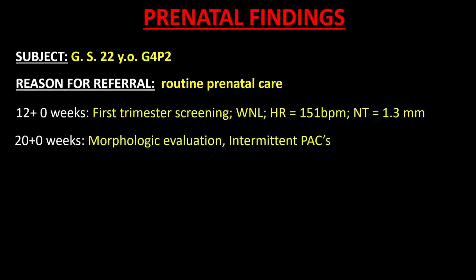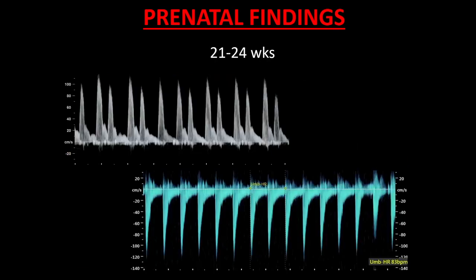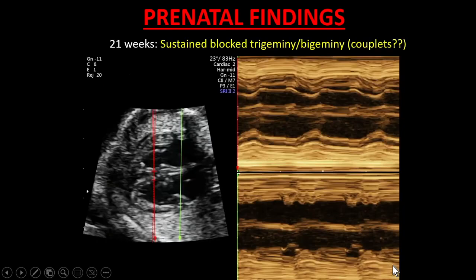And this is a contrast: the other patient presented with pretty much the same findings, ectopic beats, also in bigeminy. You can see here the heart rate is 83. This patient had a normal heartbeat and then 2 back-to-back ectopics, and that resulted in a relatively slow ventricular rate.